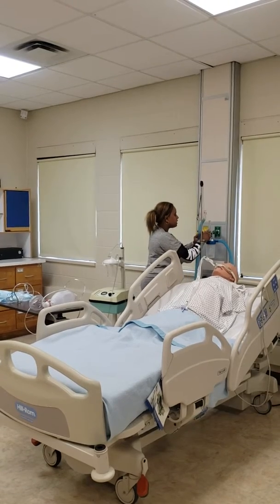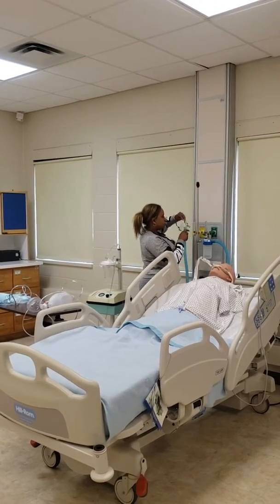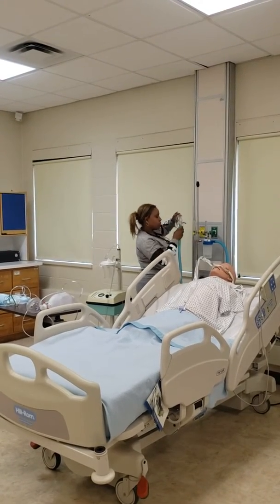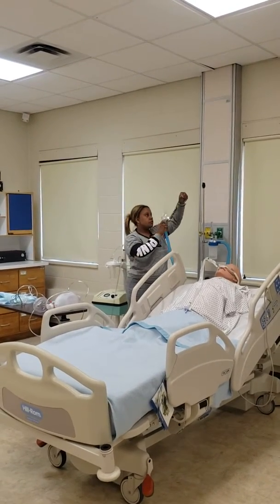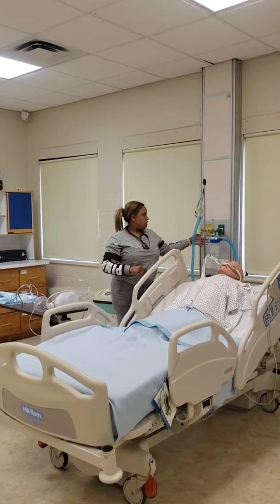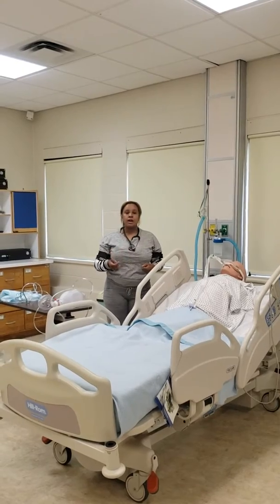I will turn it on to 10 liters per minute and make sure that aerosol is present. The large volume nebulizer will be at the same FiO2 as the ventilator.